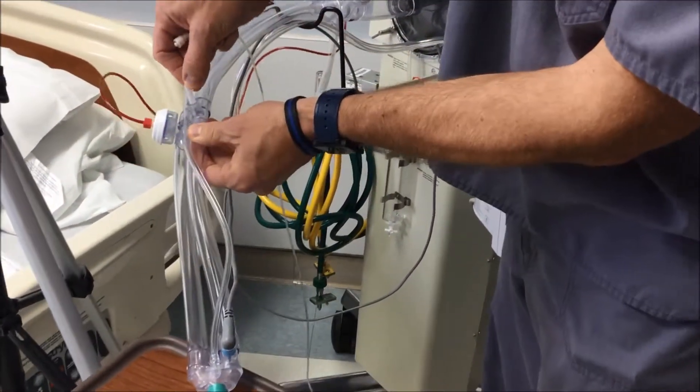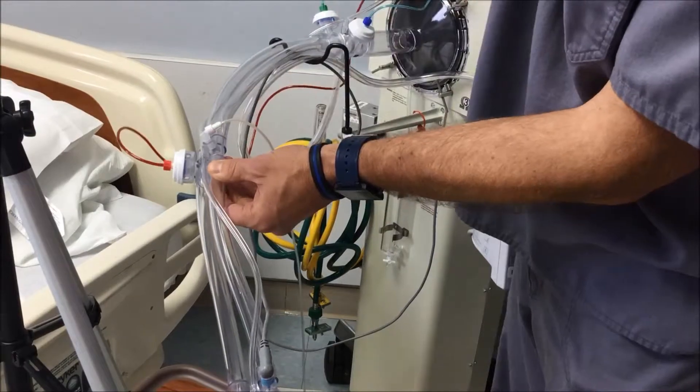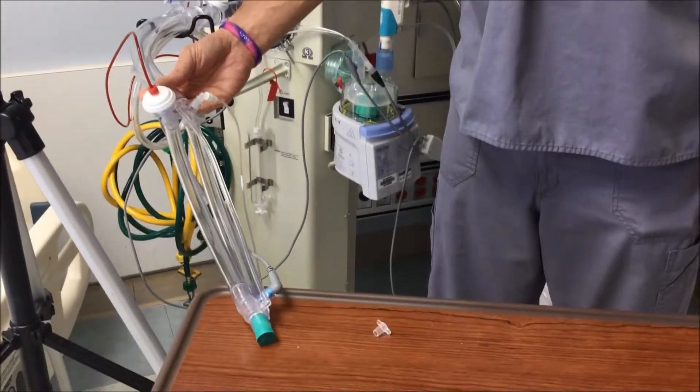Your sample line just screws into a luer lock on your 90 degree T. That's how your sample line connects to your circuitry. After that, you're ready to go to administer nitric oxide through your oscillator circuit.